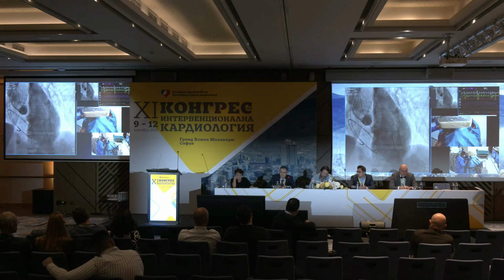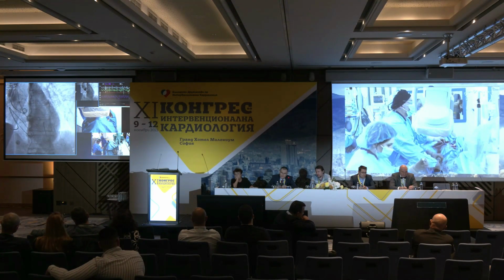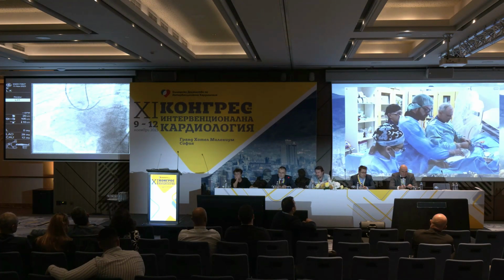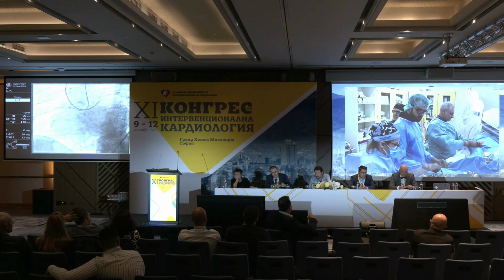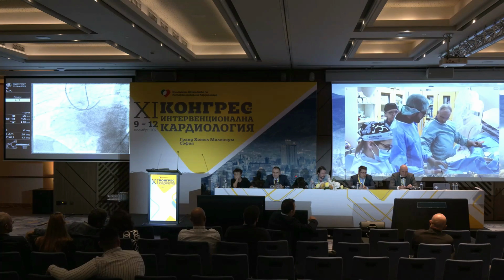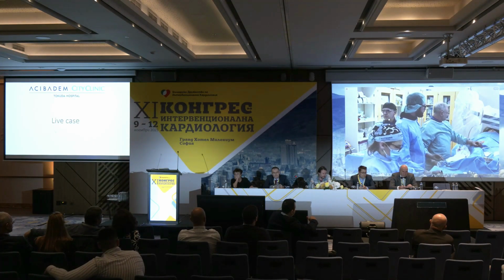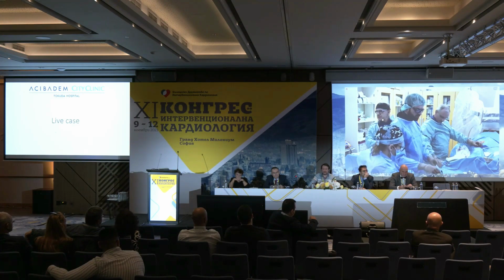Because Tokuda are ready to present their case, we will switch there and then we will go back to you. Okay, excellent. We are proceeding with the valve. Colleagues from Tokuda Hospital want to present their case. Take the wire out. Valery, you are online. So we are working on this. Let's present the case. Dr. Ramf is going to present the case.